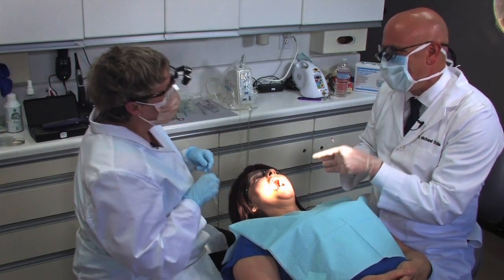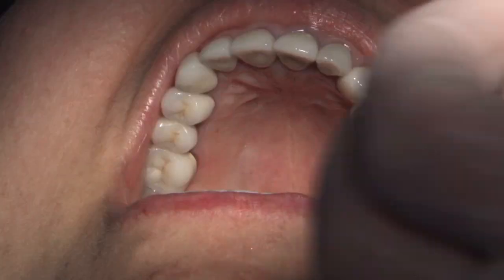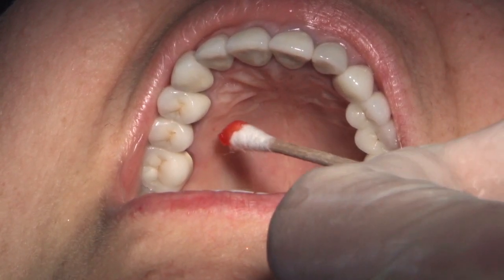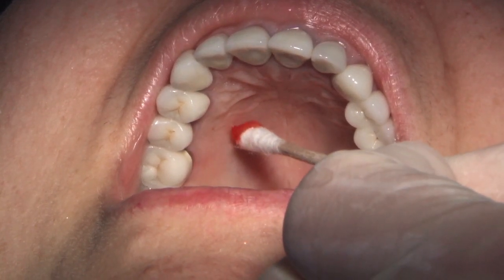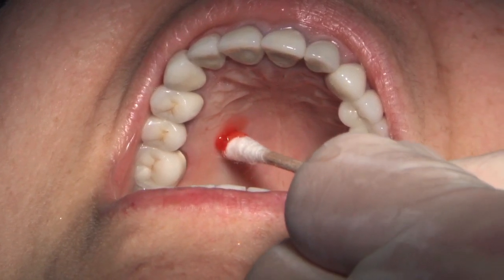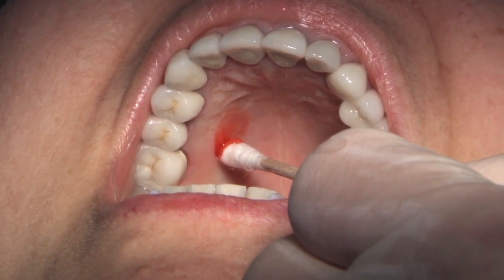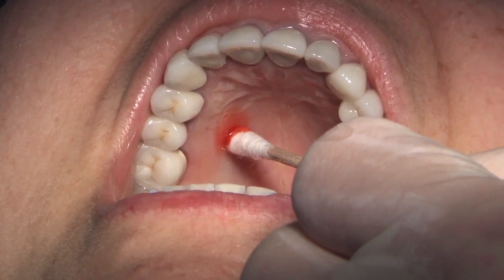It seemed counterintuitive to do it on the palate for facial anesthesia, so I'm glad you're here for the first time with me. Per your instructions, we're looking for where the curvature meets the flatter aspect of the palate, right across between the two bicuspids — right in here. You mentioned pushing around — just gently walk until you find the little thickest pad of tissue in that area, and that'll allow us to completely cover the bevel adequately and have enough tissue to take up the anesthetic.